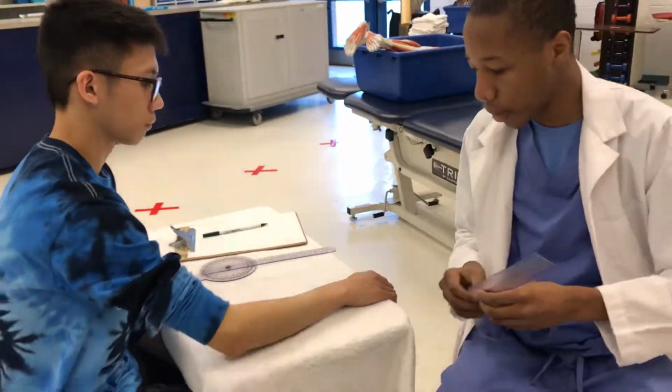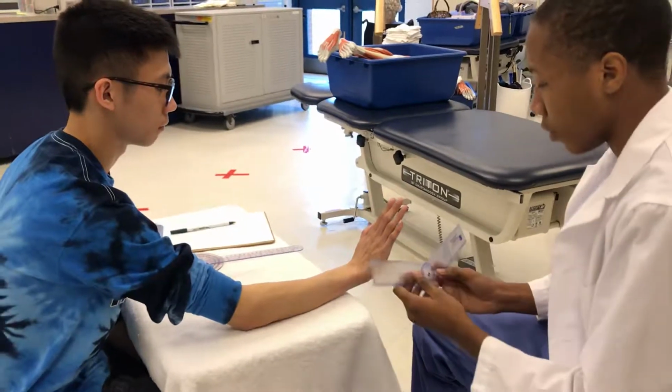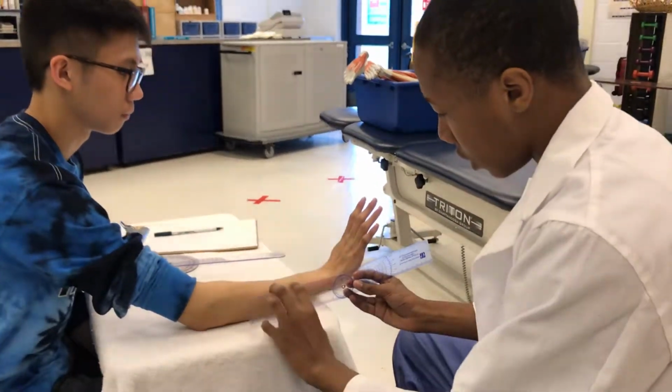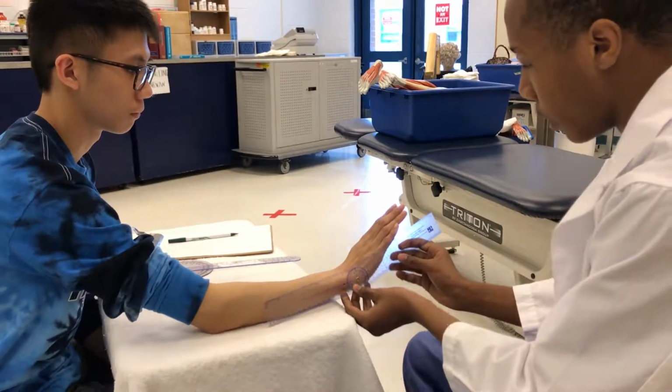So now I'm going to ask the patient to bend their wrist into extension and realign the goniometer. Stationary arm with the ulna, axis with the ulnar styloid process, and movable arm with the 5th metacarpal.